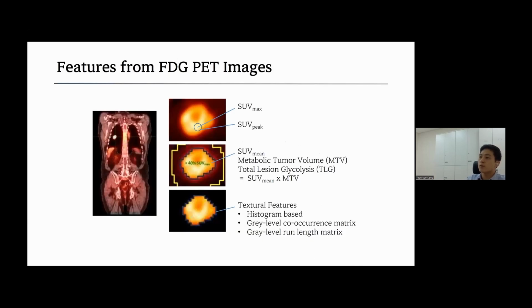As well as the above-mentioned conventional parameters, diverse texture features extracted from FDG-PET data have been investigated. And the advances in data analysis technology enable the effective and systematic analysis of this kind of large amount of information extracted from a number of features of FDG-PET from multiple cancer patients, and promoted the development of the radiomics field.